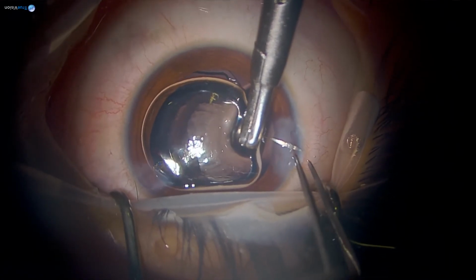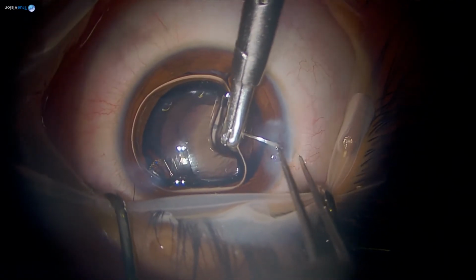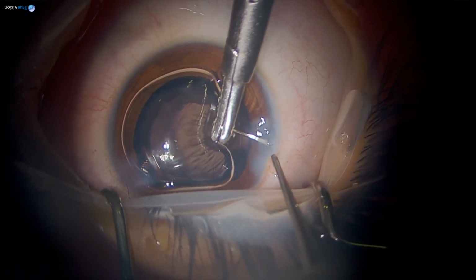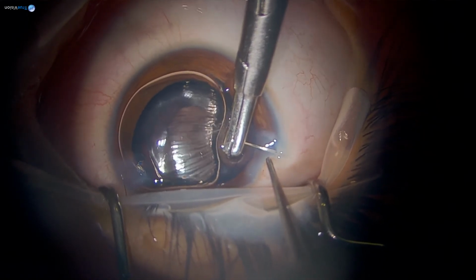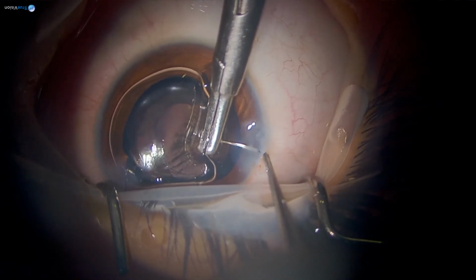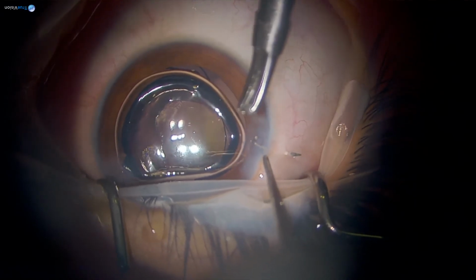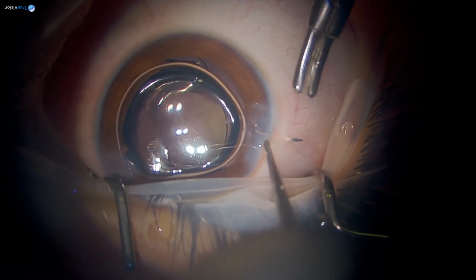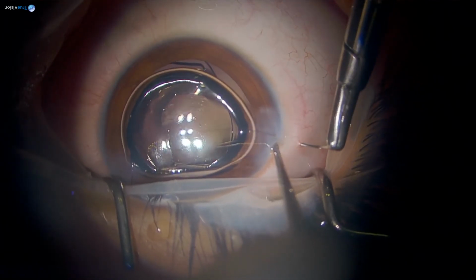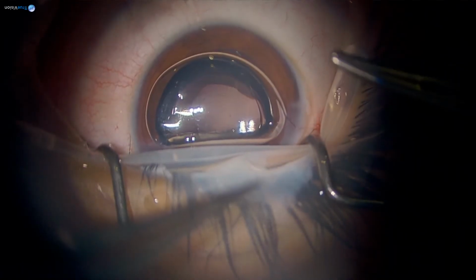Some point you're going to take out this suture, so just make sure that you are not full thickness. I'm going partial thickness here. Oh, partial thickness. Okay. The reason for that is I'm going to take it out one day. When you take it out, I don't want infection from the cornea to go into the intracameral area and cause infection. But you need to be very, very careful that you are partial thickness, not full thickness. Very, very important.